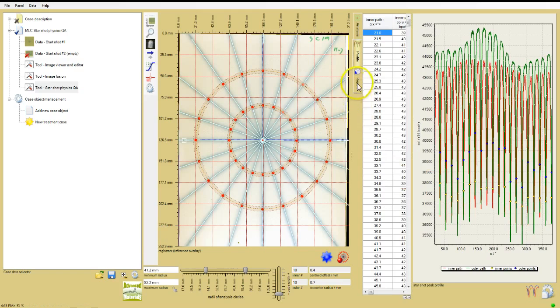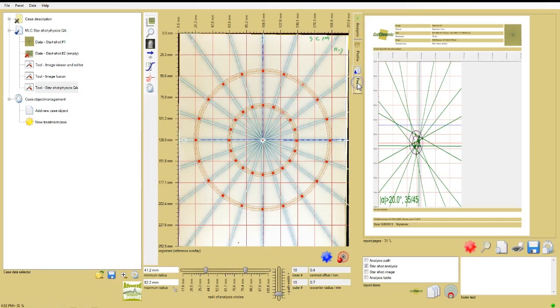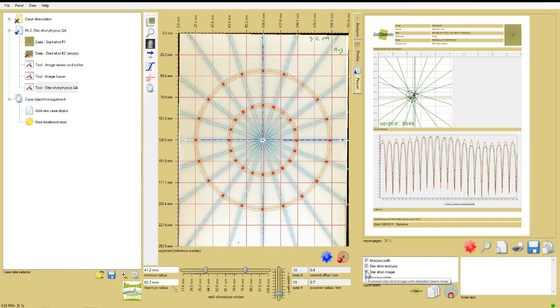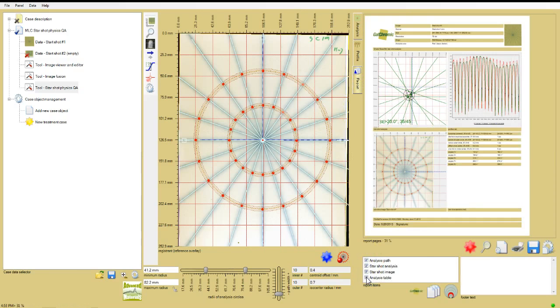Now click on the report tab and at the bottom of the window, check the items required in the report. In this case, I'll choose all four: analysis path, starshot analysis, starshot image, and analysis table.